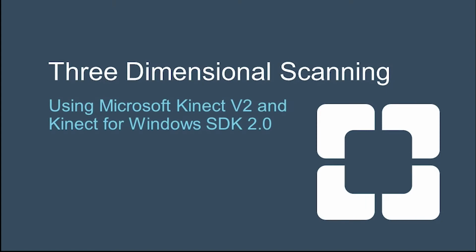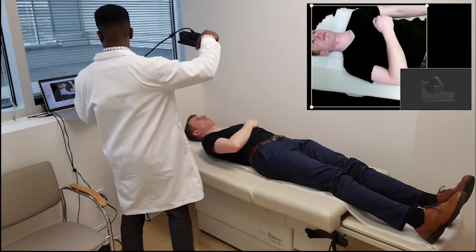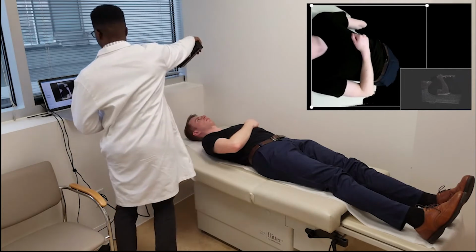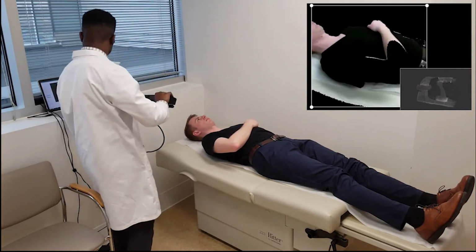3D scanning was performed using a Microsoft Kinect and a laptop computer. To protect patient privacy, a volunteer was used to demonstrate the 3D scanning process, which can be easily accomplished with the patient supine on a standard exam table or hospital bed. In the top right of the screen, the inset video shows a view from the Kinect's cameras, as well as the live generation of the 3D point cloud.